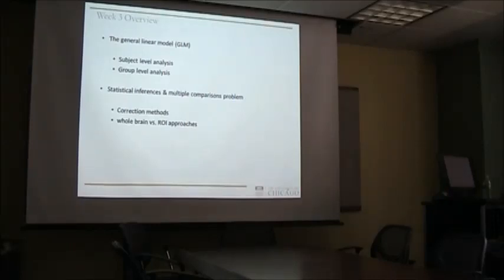For today what I had in mind is to talk about two main topics in the statistical analysis. First one is to talk a little bit about the general linear model, which is the main statistical framework to analyze your data. And the second part is what kind of statistical inferences you make, and especially pay some attention to the multiple comparison problem. What kind of correction methods are there, and what kind of different approaches you have.